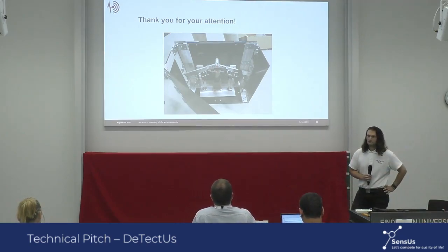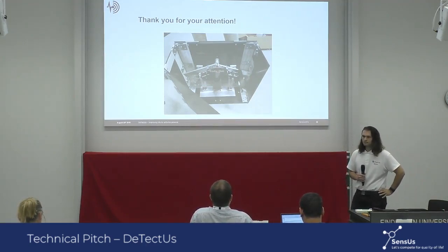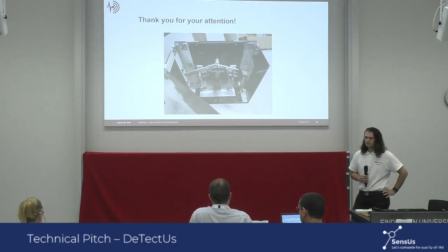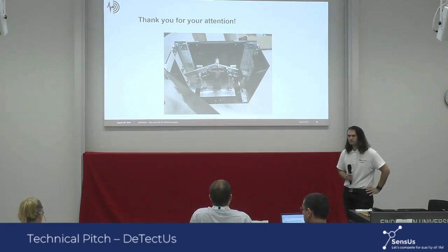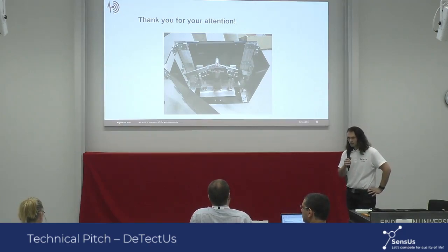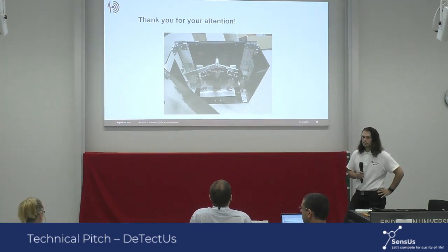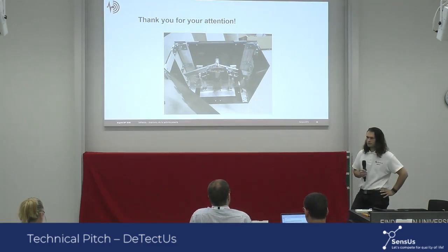So thank you for the presentation. I like that you use peptide mimics that can bind to the antibody. I have two questions. The first one is that you mentioned you block for non-specific interaction. How did you block for non-specific interactions? With ethanolamine, as far as I can recall. Yep. And did you verify how much background signal you get after that blocking step from just plasma without adalimumab?